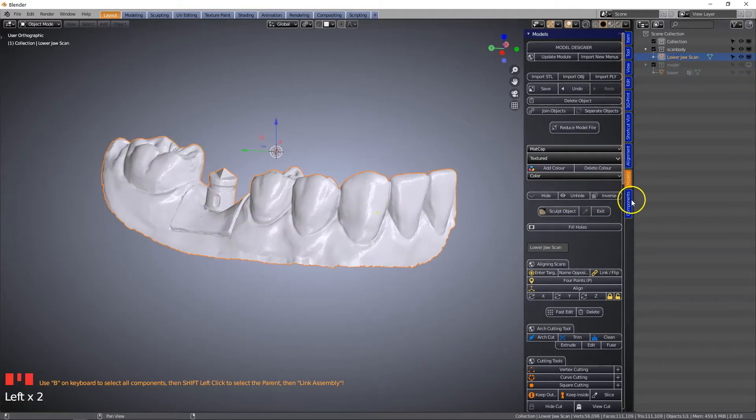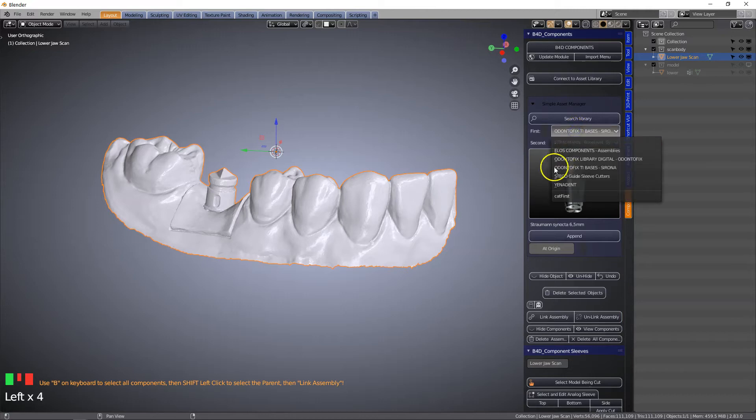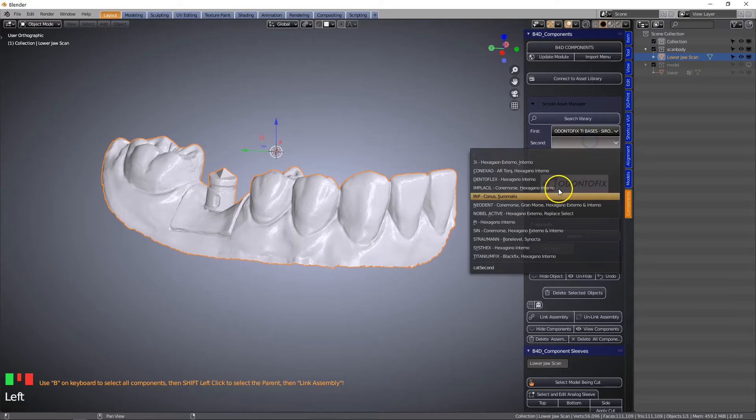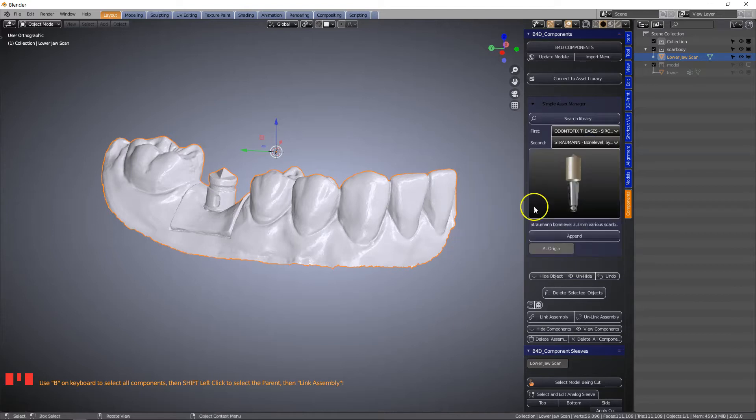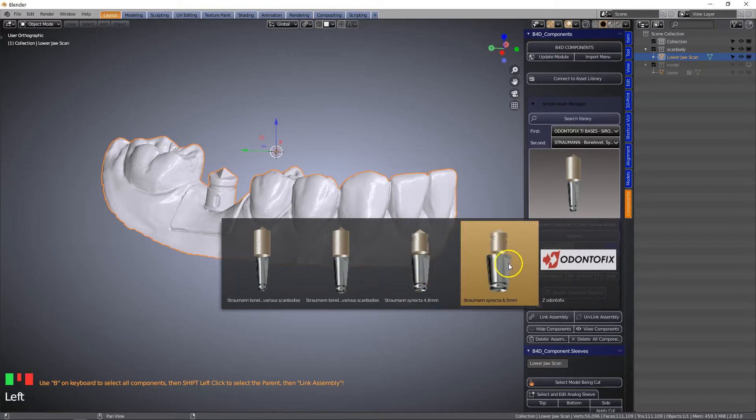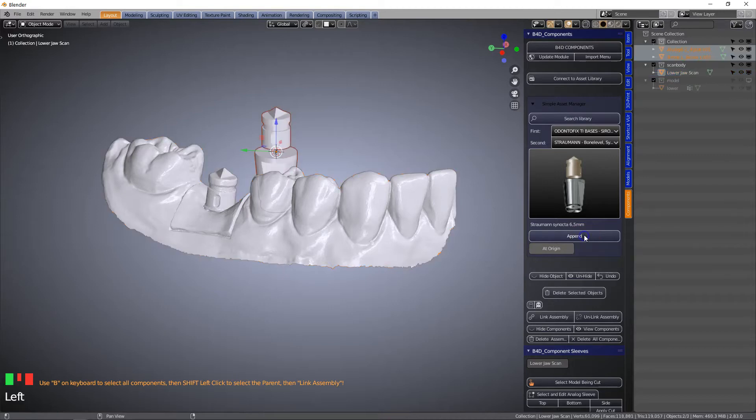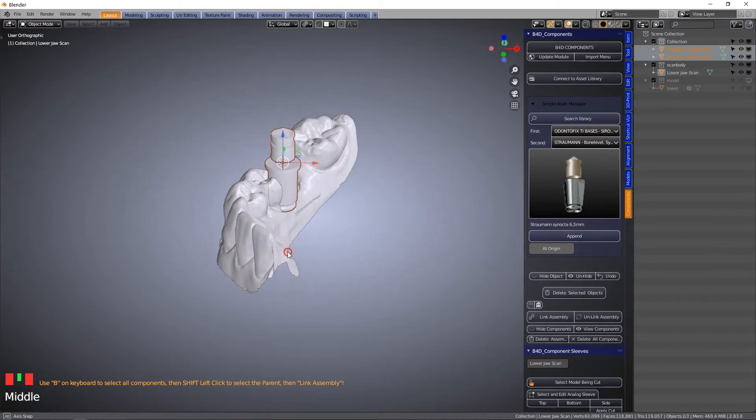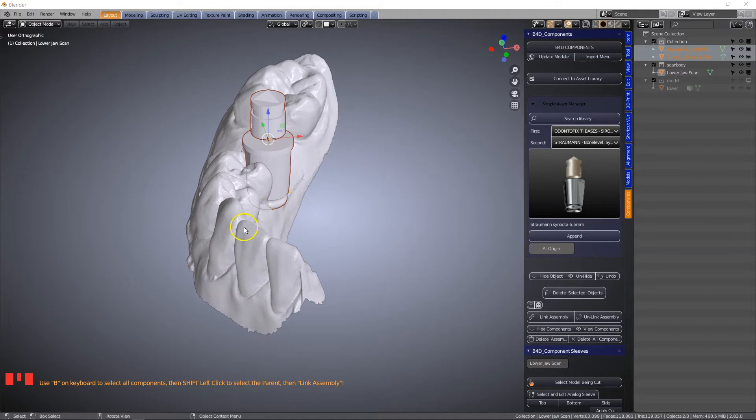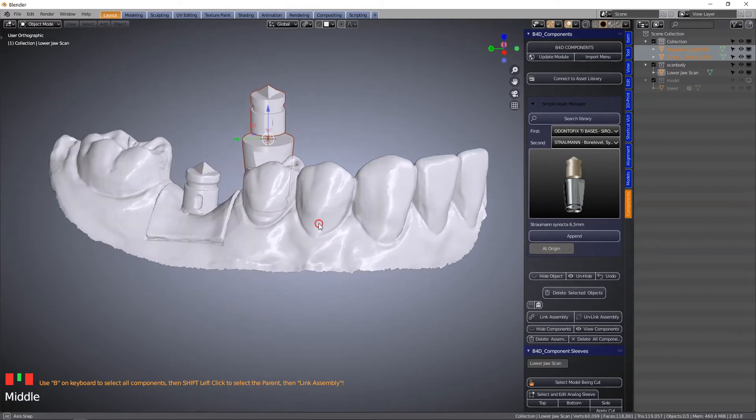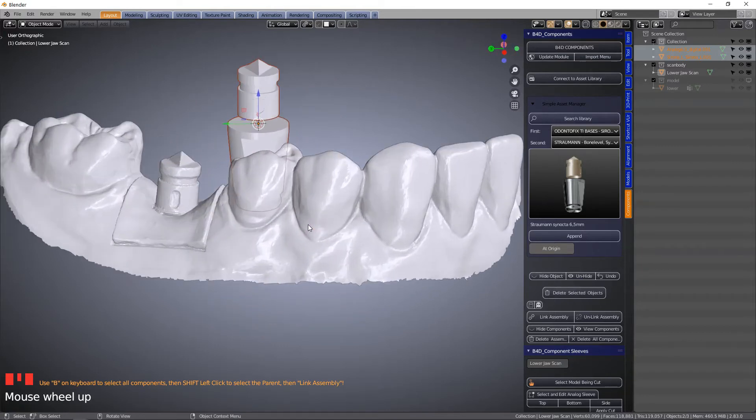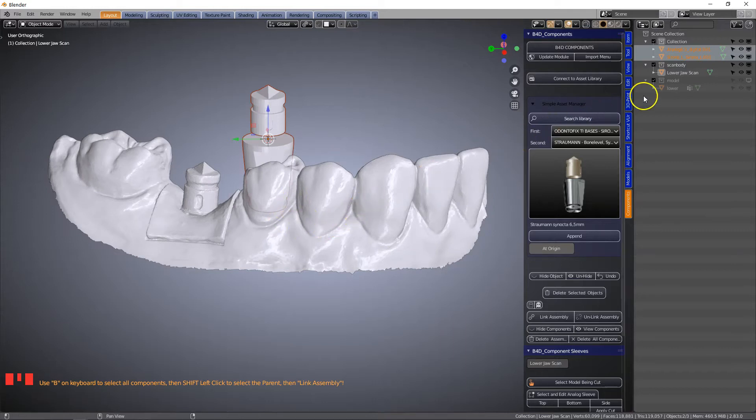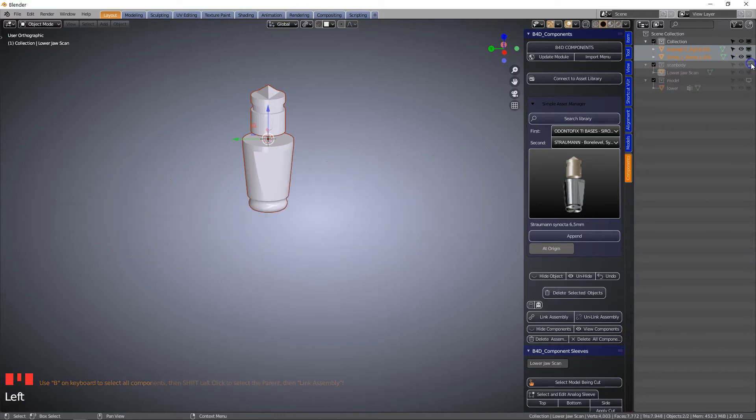Then I'm going to go to the component module and go to the Odontofix Sirona. We're going to be choosing a Straumann bone level with the dimension of the analog 6.5 millimeter and we're going to append this into the scene. Without moving this component, I'll leave it exactly in the center of the scene where it has been imported. We can hide the scan body as well.